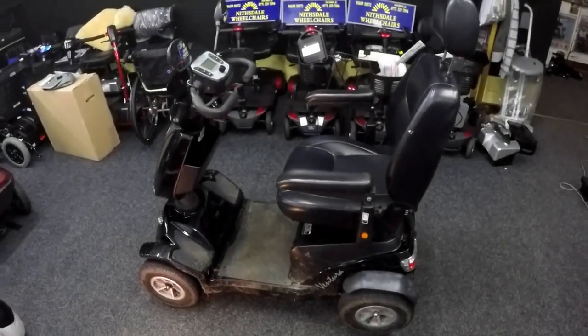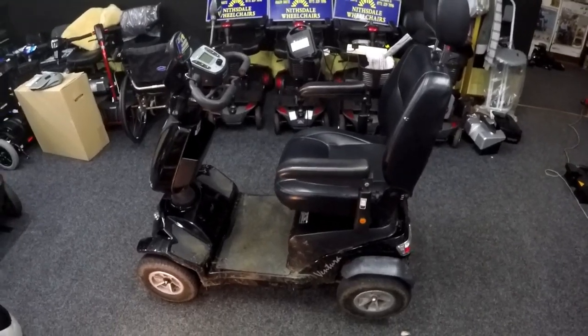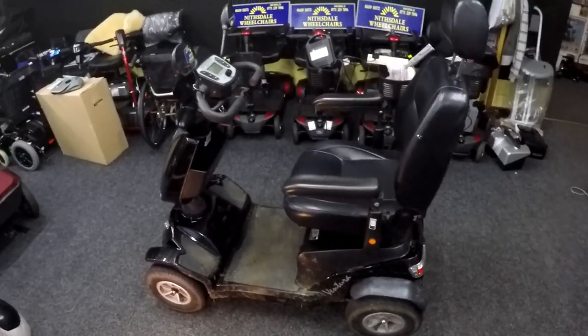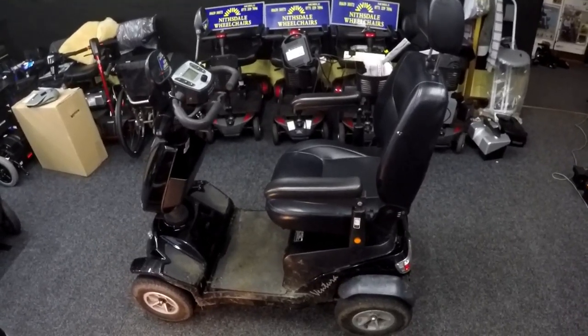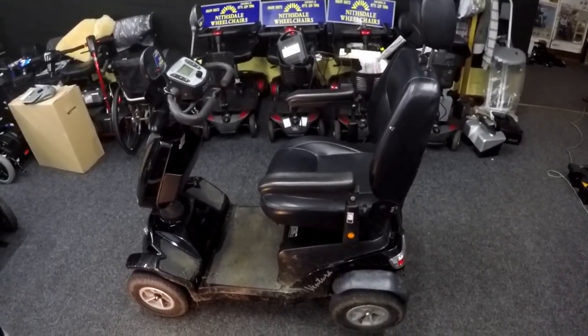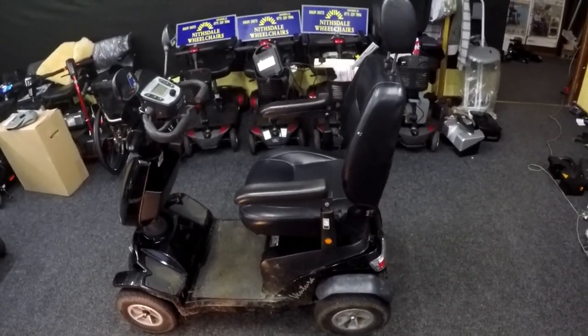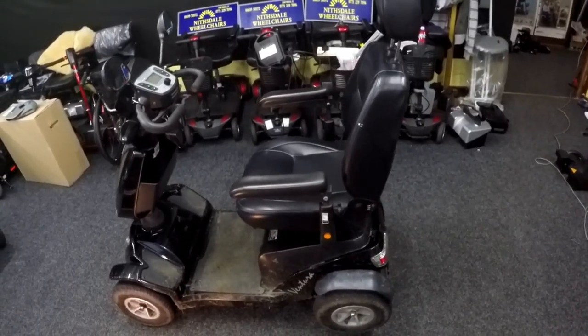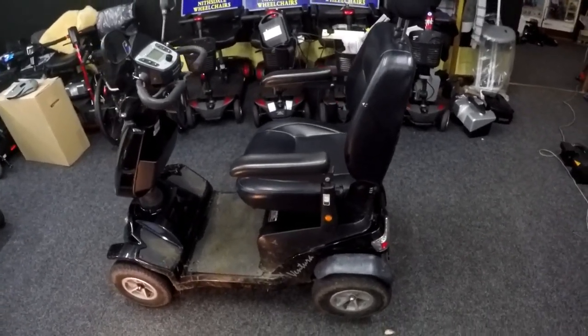Today we're going to be looking at an electric mobility Rascal Vision mobility scooter. Our customer has bought this from a so-called dealer in Lesmahagow up in Scotland. He sold him the scooter telling him it was 2 years old when actually it wasn't. It was 4 years old. So it's been well used, well rusted underneath, most likely it's been kept outside.